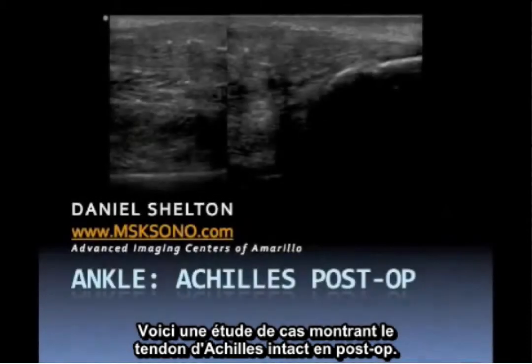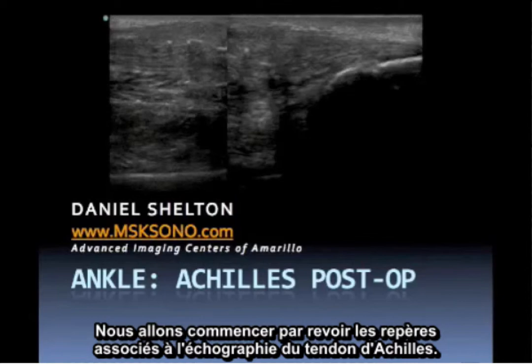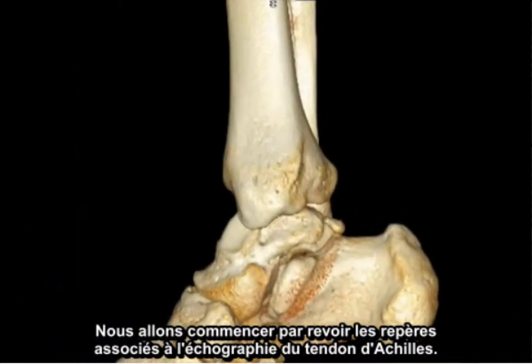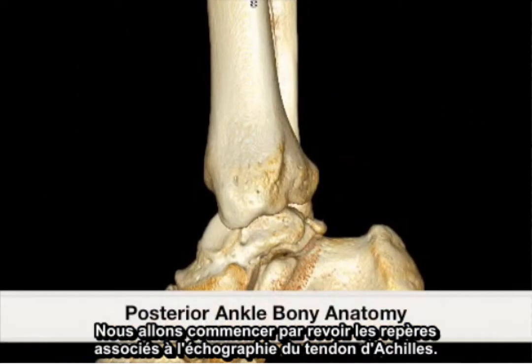This is a case study representing the intact postoperative Achilles tendon. We will begin by reviewing the landmarks associated with ultrasound of the Achilles tendon.